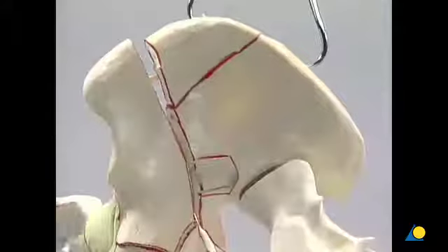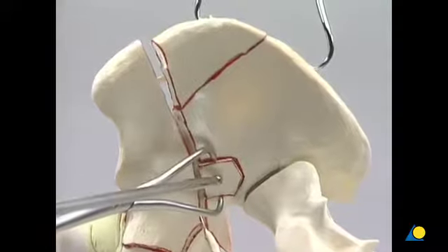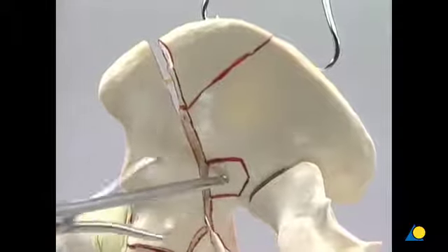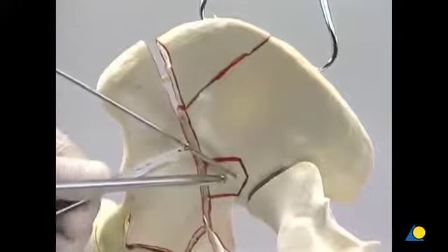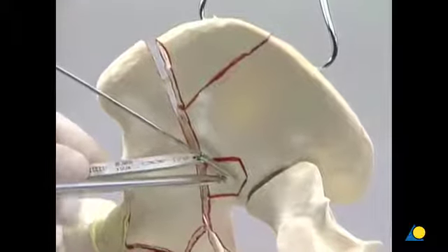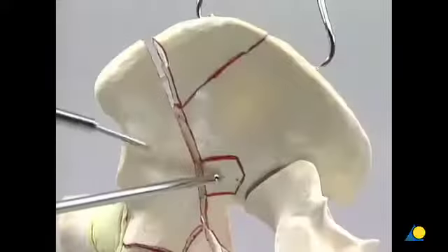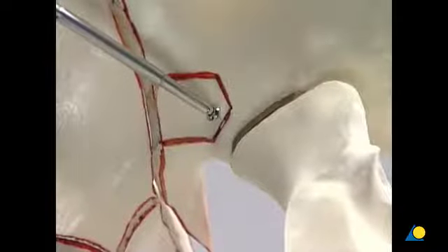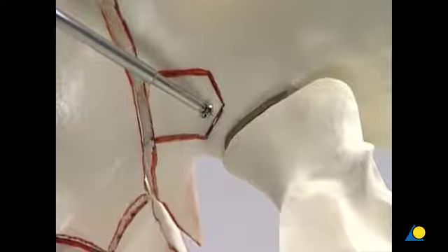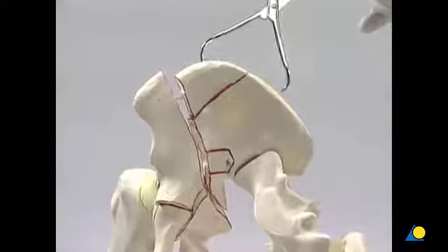Then the small free fragment of the inner posterior aspect of the pelvis is repositioned. The ball spike is used to exert pressure, and a lag screw is inserted. Even though this fragment is non-articular, anatomical reduction is mandatory to ensure the overall alignment of the fragments. The pointed reduction forceps is removed.